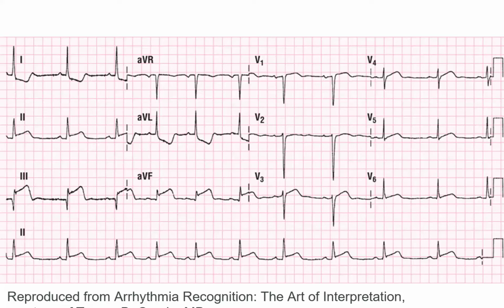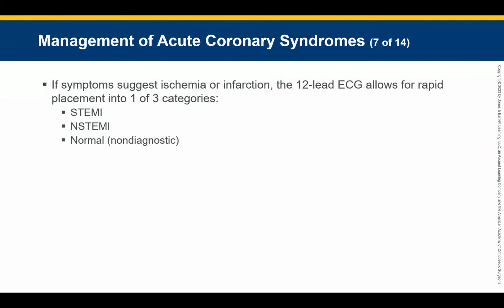Ours says no, don't do that. We want to support them. Maybe we can have a conversation. Ours says if you have inferior, consider right-sided. ST elevation noted in severe cases, nitro and or opioids may cause hypotension requiring fluid. So still do it. All right, that's what it's saying. Let's keep going. We'll talk more about that another time.